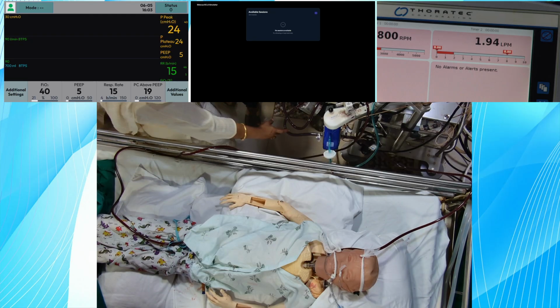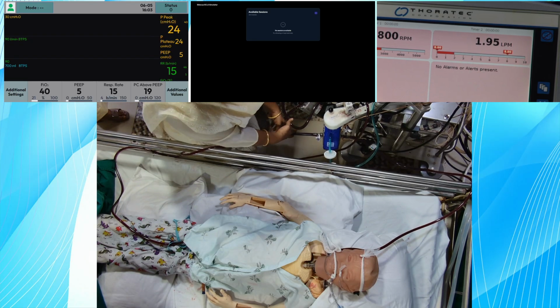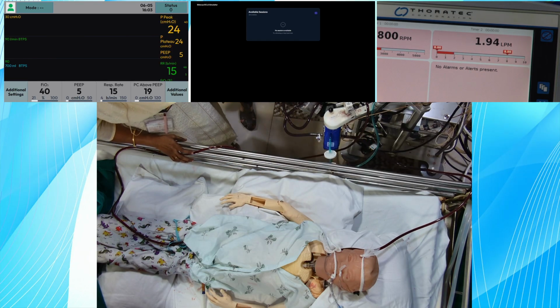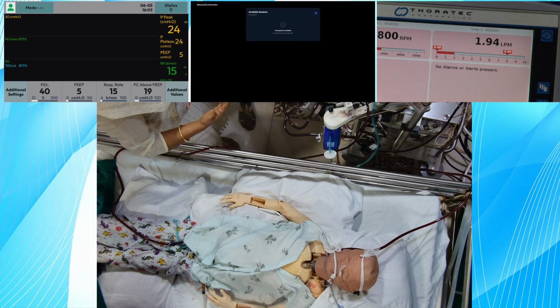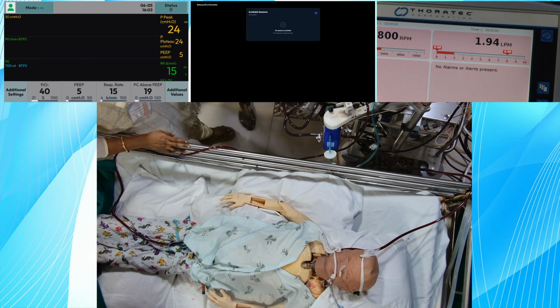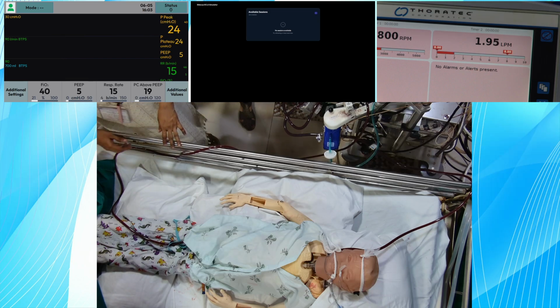Where do we have to plug this? This oxygenator also needs a new clamp, right? Let the monitor come at least. No, in the meantime we can plan it. Yes, we have an extra oxygenator in the room. Should someone start priming the oxygenator in case we get clots? We have to take out the oxygenator.